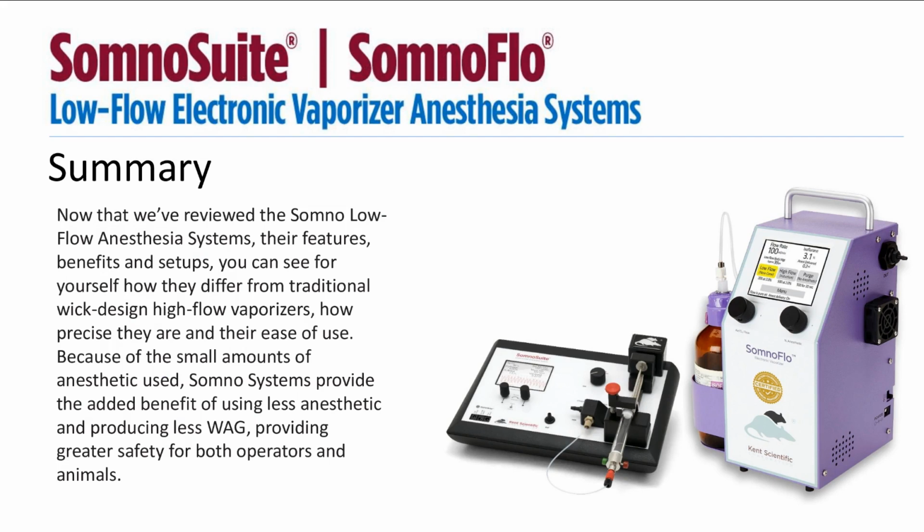So throughout this presentation, you have seen the features and benefits of our low flow anesthesia systems. They are simple to use and are able to deliver precise amounts of anesthesia. The safety benefit of the SomnoSuite and SomnoFlow come from the small amounts of anesthetic used. Using less anesthetic produces less waste gases, and leads to greater safety to both your animals and your operators.